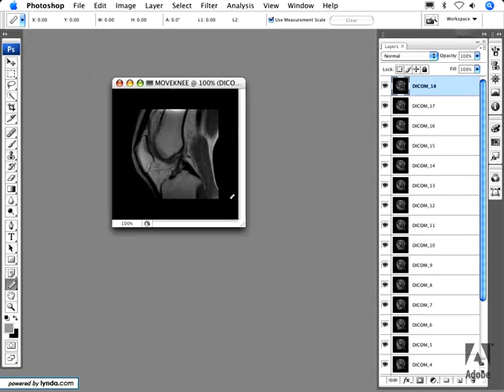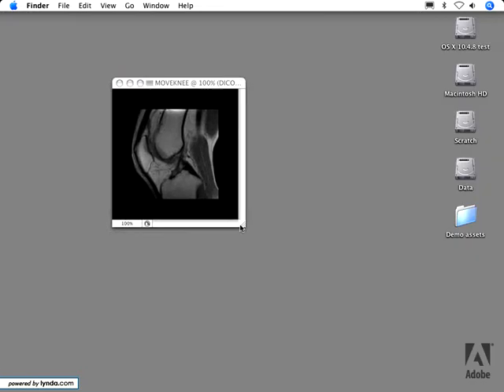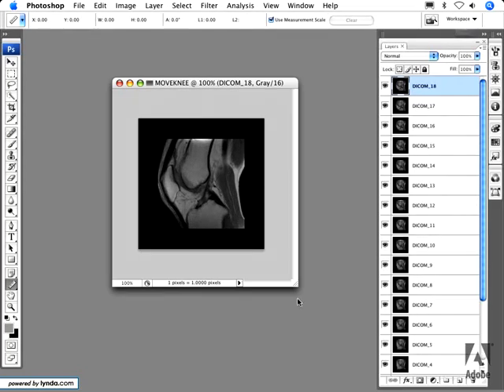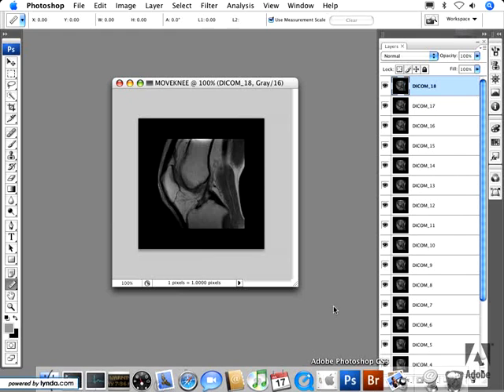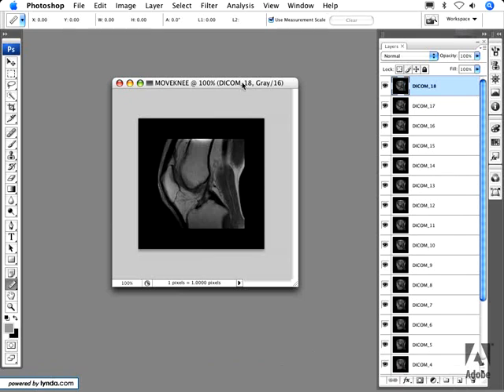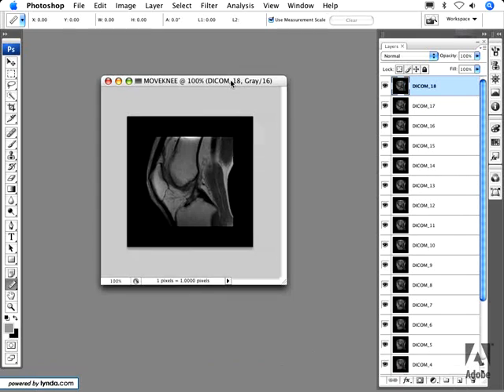You can also save out as DICOM. However, if you do certain things that are not able to be saved within the DICOM specification — such as creating an annotation on an image — Photoshop will ask you whether or not you want to discard this information in order to save within the DICOM specification.